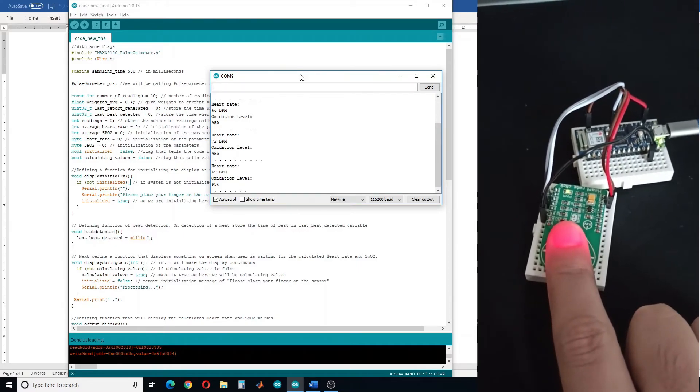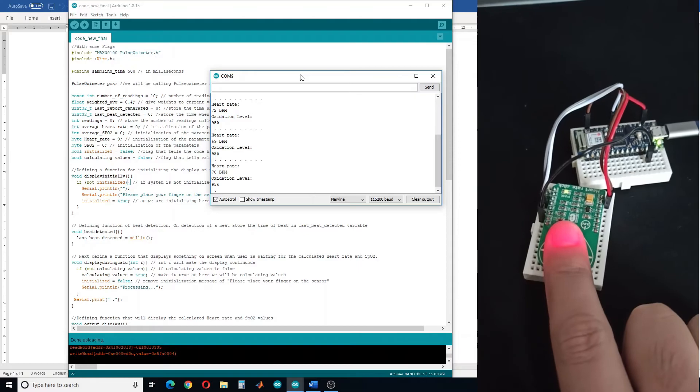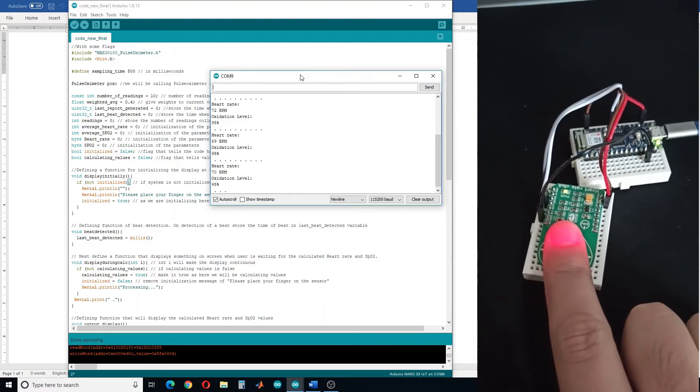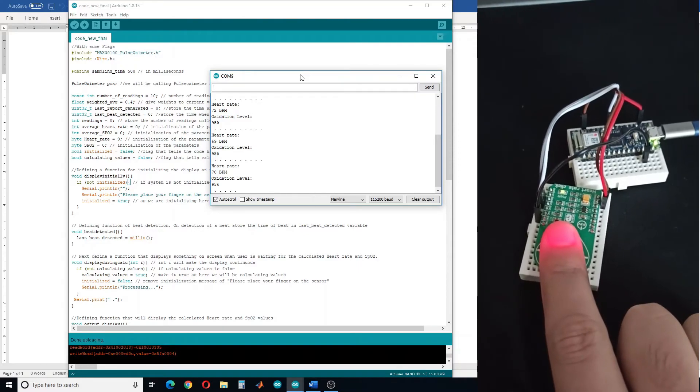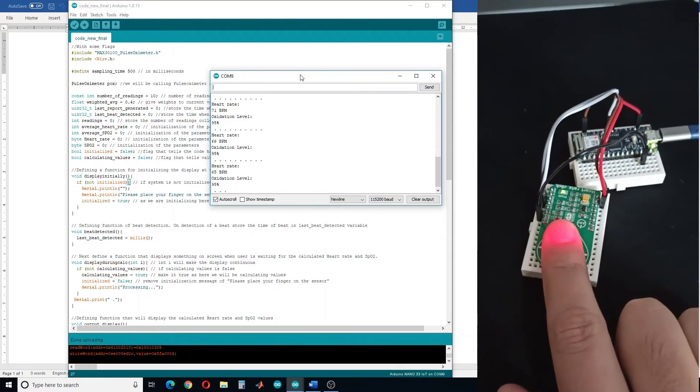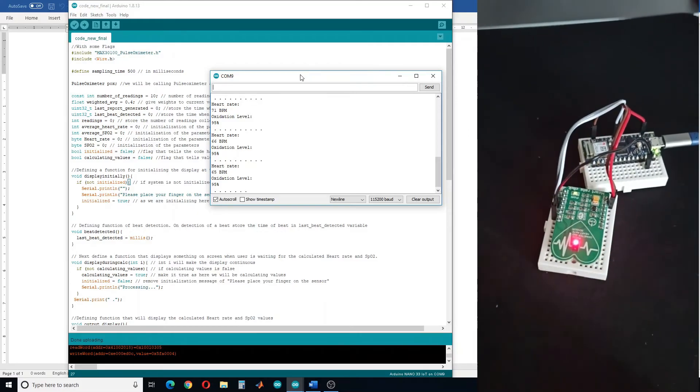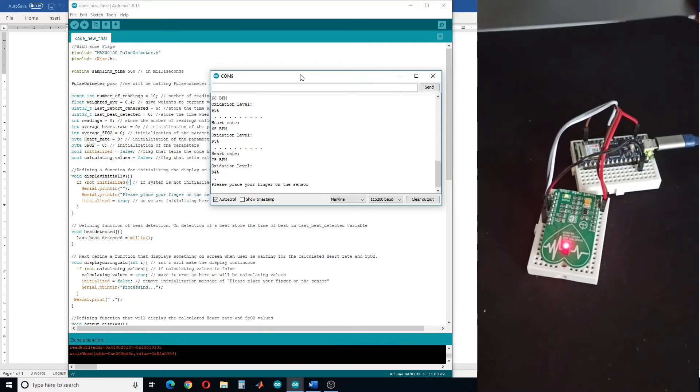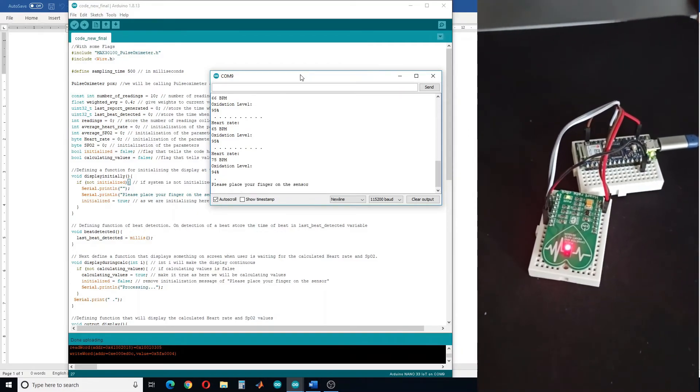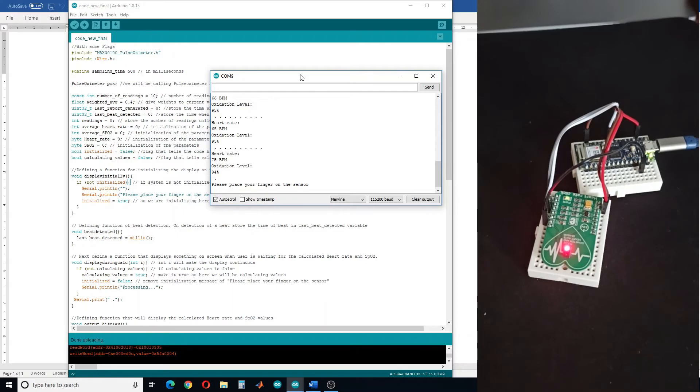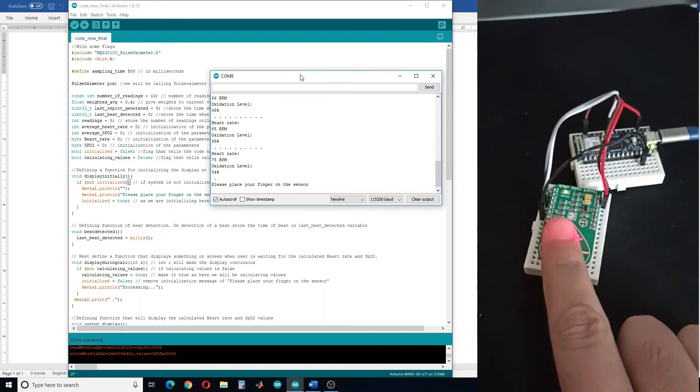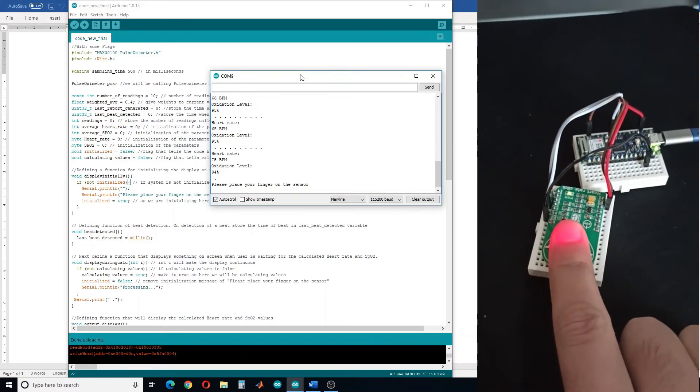You can see that now it is giving me a stable output. When I remove my finger from the sensor, after a few seconds it shows "please place your finger on the sensor."